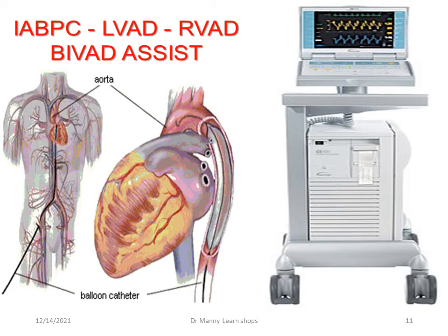Also, in the intensive care, you may require post-cardiac surgery intra-aortic balloon pump counterpulsation, left ventricular assist device support, right ventricular assist device support, or biventricular assist device support. Typically, biventricular, right ventricular and left ventricular assist is in pediatric cardiac surgery, intra-aortic balloon counterpulsation more so in adults, but all can apply.